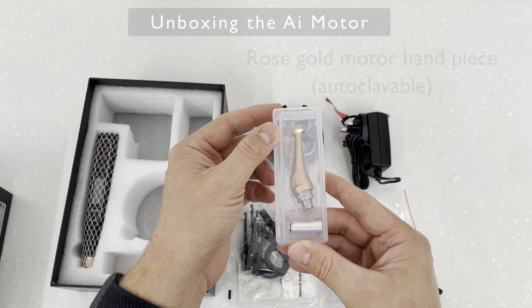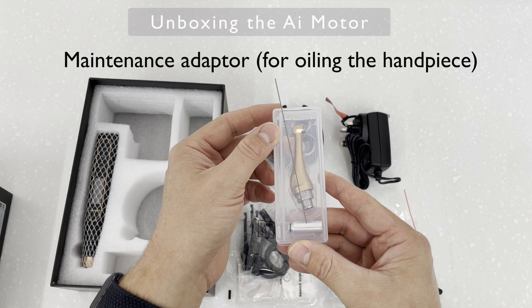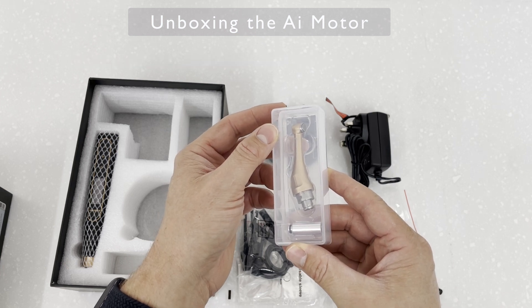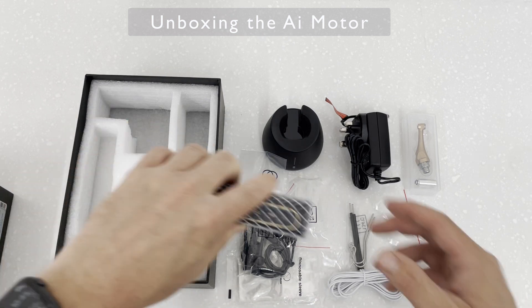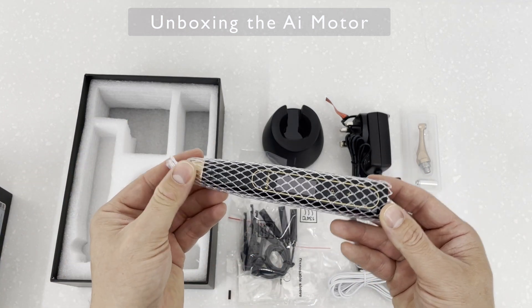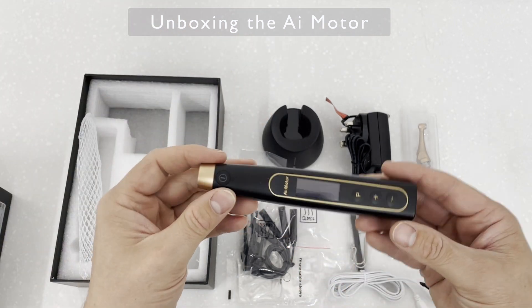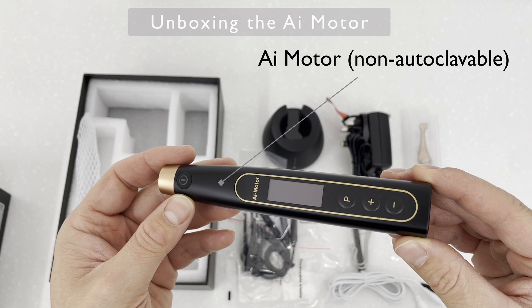You get a rose gold motor handpiece, which is autoclaveable, and also a maintenance adapter used for oiling the handpiece. And finally, the AI motor itself, which is of course non-autoclaveable.